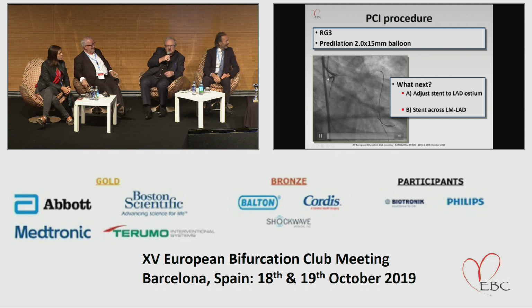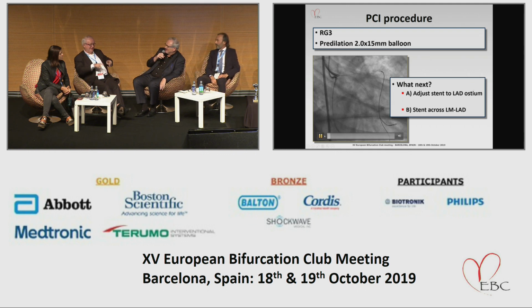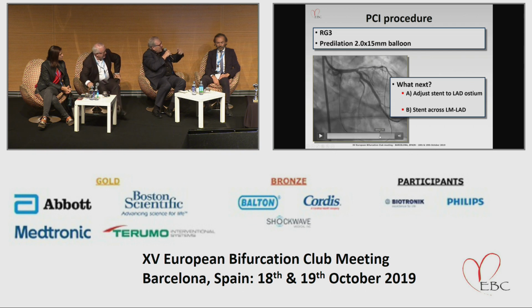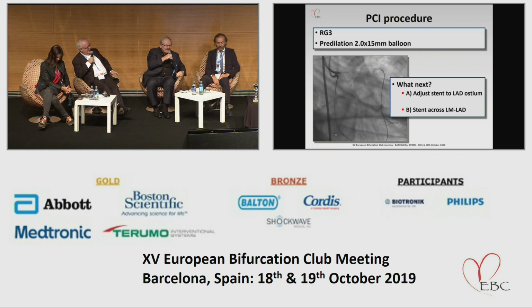I mean, maybe he attempted not to recross, but to use two stents, à la Gun. You remember that? Gun was putting two stents, a barrel technique, in the main stem, which has not very good long-term results. At a certain point, S.J. Park was doing that, and we have all seen those famous IVUS pictures where you see intimal hyperplasia on both sides of the metal, indeed with the two stents in the main stem. That's maybe the temptation of Chico, no?